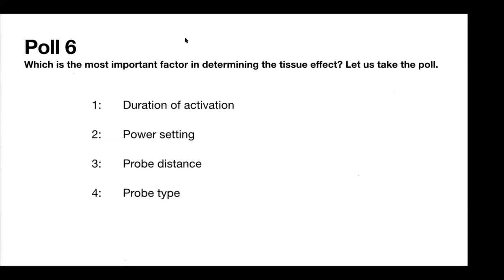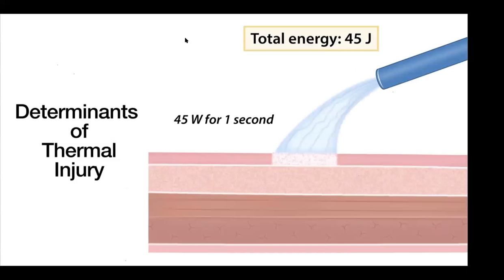All right. I'm glad that you all got right quite a bit. Let us look at what the literature says. But before I go there, I think the art of electrosurgery or the art of APC is to limit the depth of thermal injury to the target tissue and you don't want to go beyond that. If there's a mucosa, just ablate the mucosa. You want to control that.